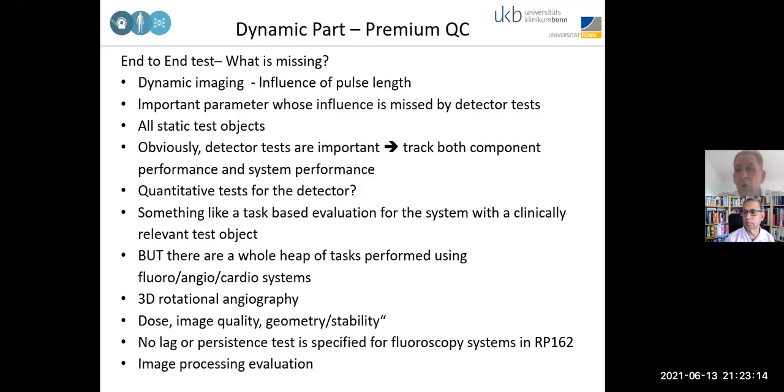You don't look at the raw data, do you? You already look at processed data. And everybody who knows about processing of data knows it has already changed, so you should actually look at the real raw data and not the processed data. And that is not really something which is evaluated so far.